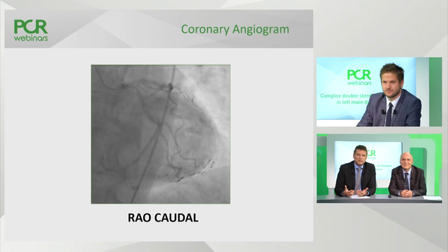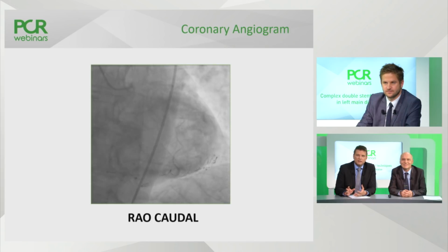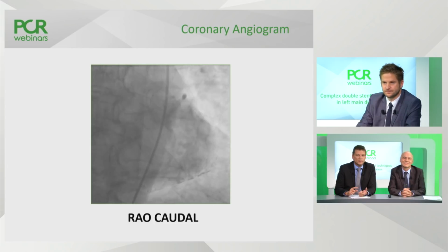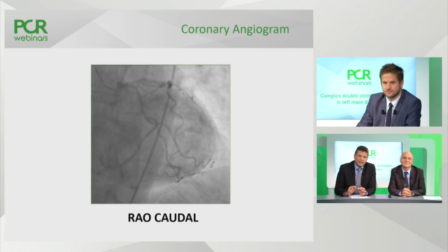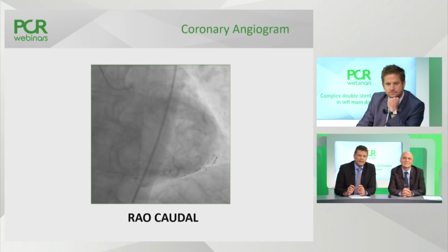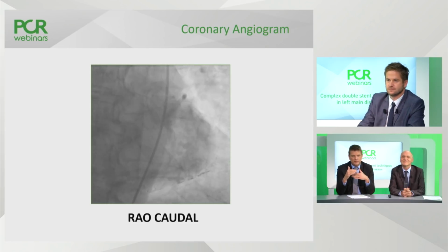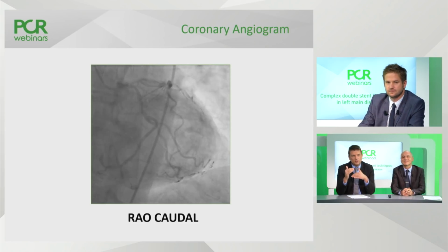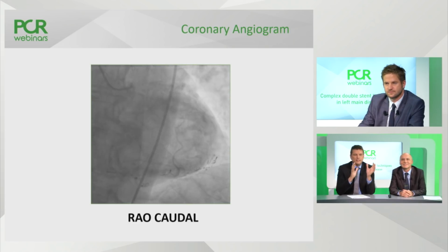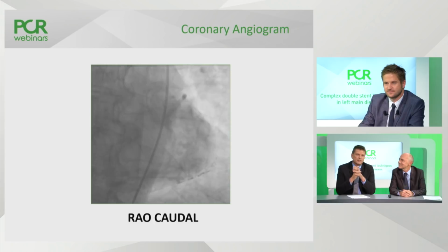And then the dissemination of disease is different. I mean, you obviously see this proximal LAD stenosis, and you see at the origin of the LAD a lot of calcium, which we didn't see in the previous case. And what is also interesting, in the ostium of the circumflex, you have moderate but diffuse disease. And now look at the left main. What is always one of the criteria that I use is I look at the left main. And if the left main is not bigger than the circumflex, then I usually believe it's diffusely diseased. So I would say it's diffuse disease, left main to circumflex, and the tight stenosis in the LAD with calcium.